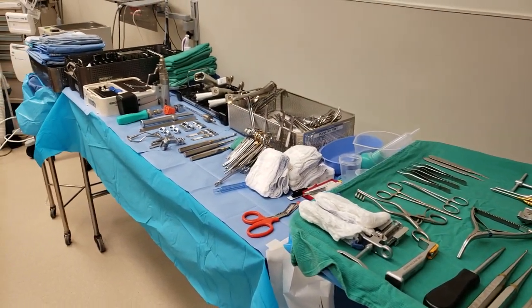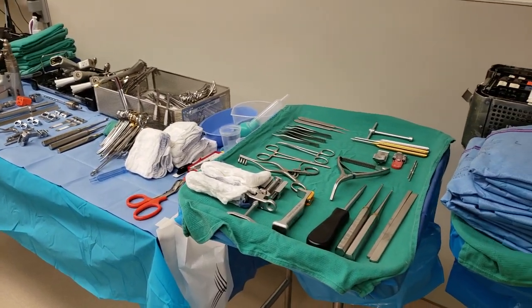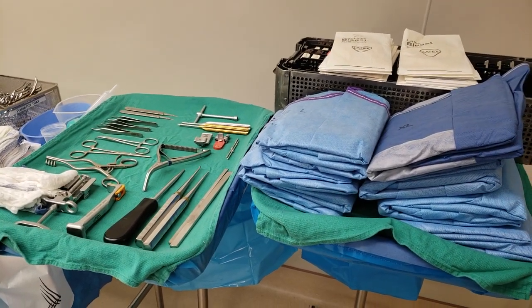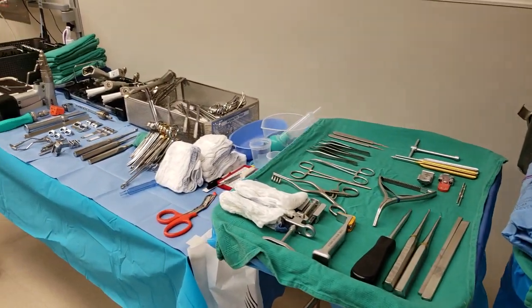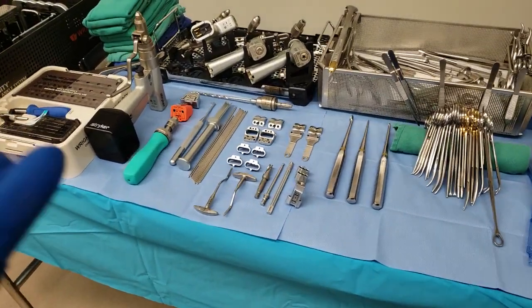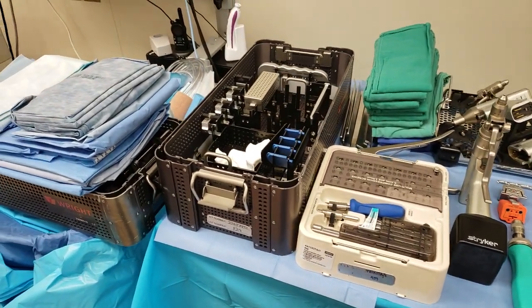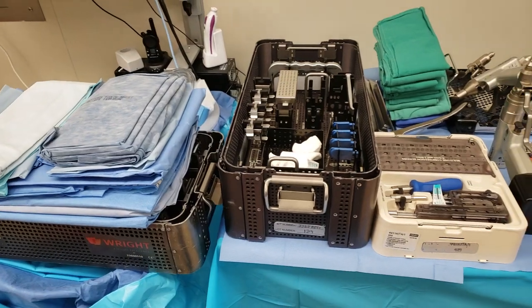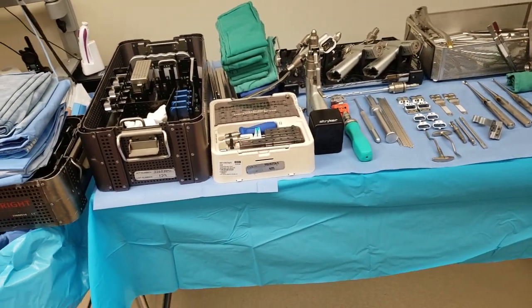Hey guys, I'm back again with another video, and this time it's a total ankle arthroplasty. This is a very complex, very complicated case. And as you can see, I tried to consolidate everything since I need as much space as I can for the rep trays and just to organize things so that we're not all confused of where things are when we're in the case. So times like this, when you don't have enough back table in the operating room, you just kind of have to figure it out.